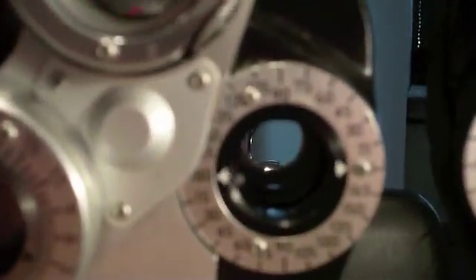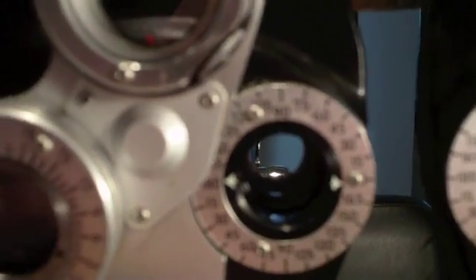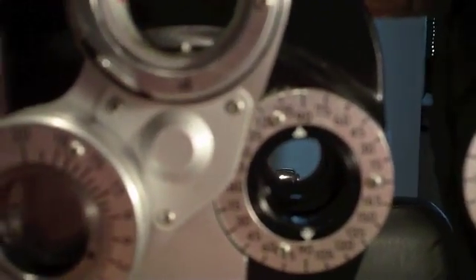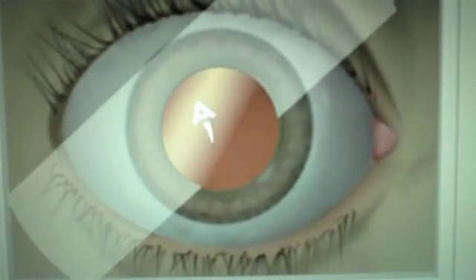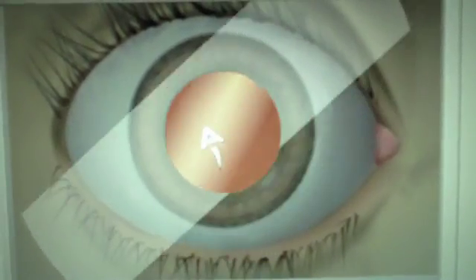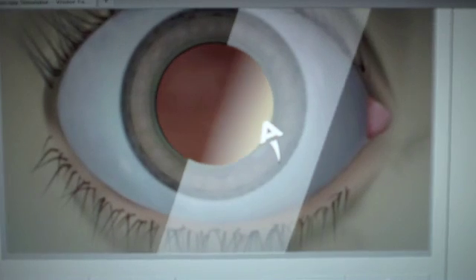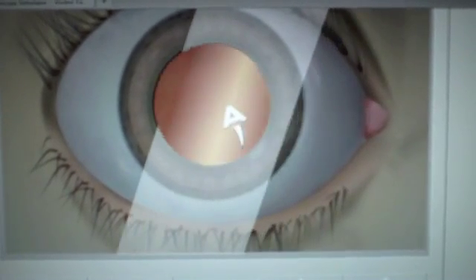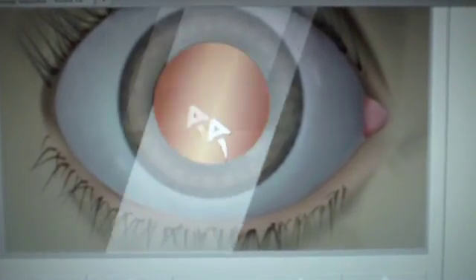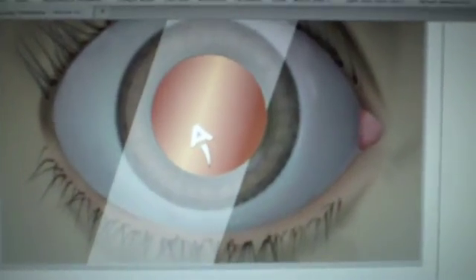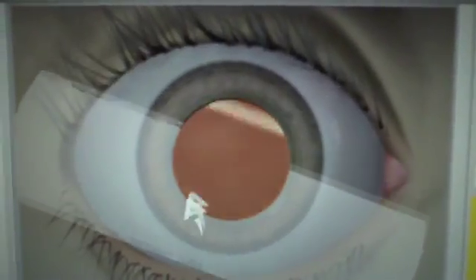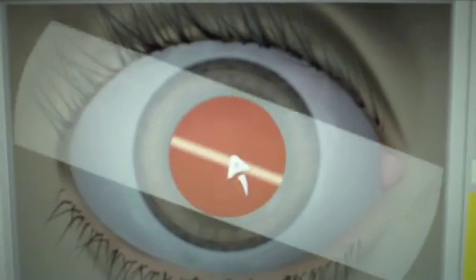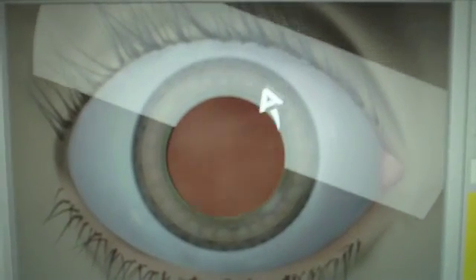Here's a close-up — we're turning this dial, and you can see the arrows are moving to line up. We make sure the lines are lined up. Here you can see we're getting closer, and right here they line up perfectly. Also, 90 degrees away it should also line up perfectly, because that's just how the eyes work. You can see that they do line up perfectly, but the lines are moving in opposite directions — and that's another clue that we can use.